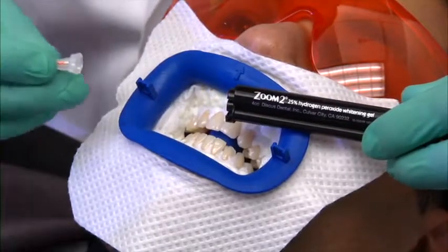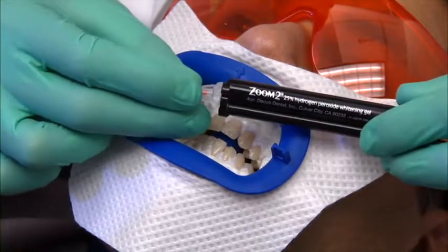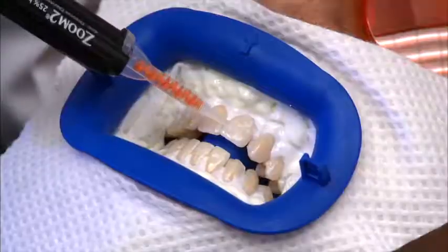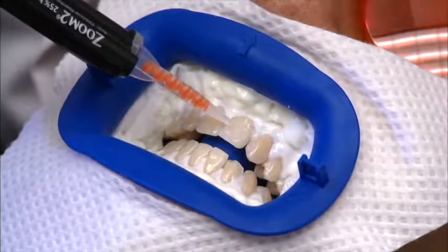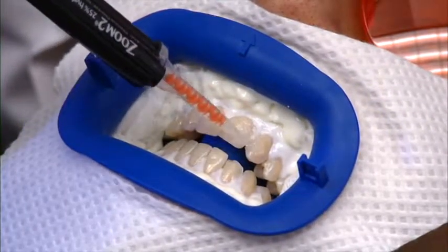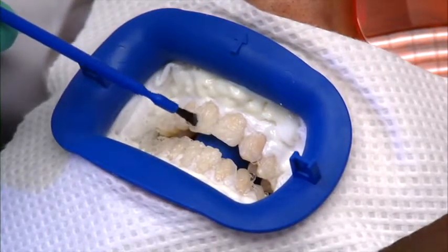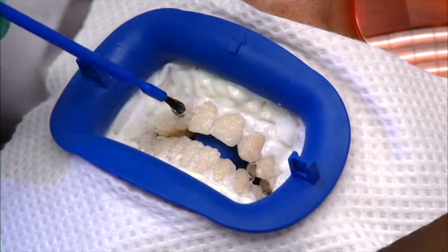Remove the cap from the room temperature Zoom whitening gel syringe and attach the mixing tip. Now, apply the gel directly from the syringe to teeth about 1 to 2 millimeters thick, using the blue brush provided to ensure proper placement of gel.